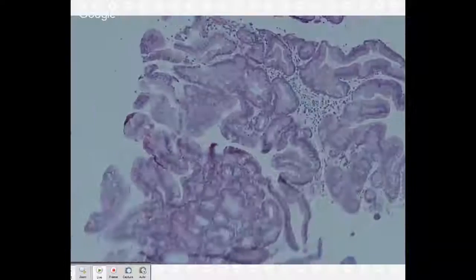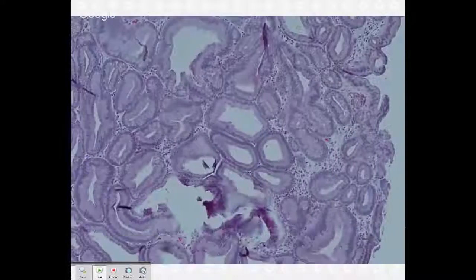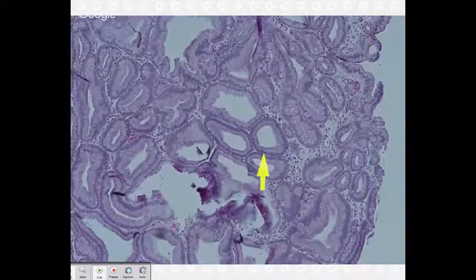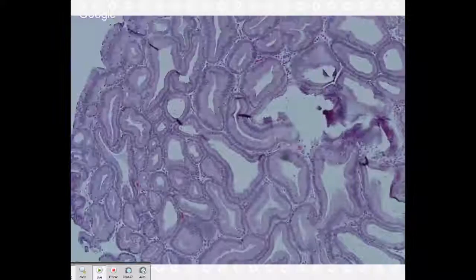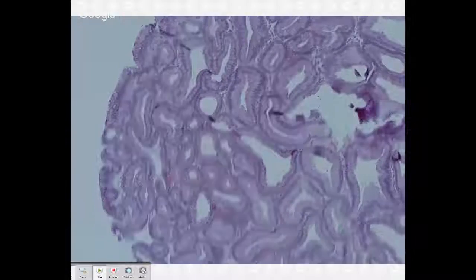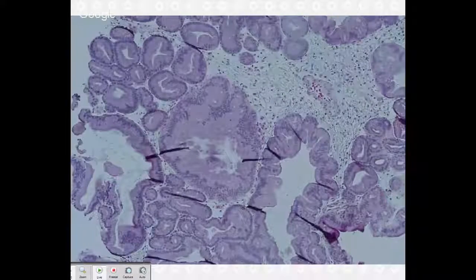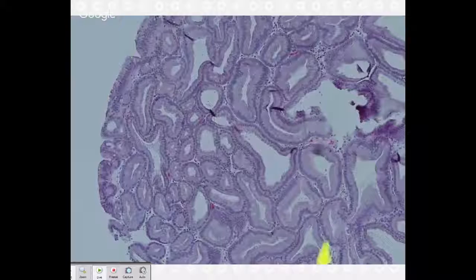How would you describe the cytoplasm? There's abundant cytoplasm. It has, I guess, apical vacuoles. Is it pink? Is it purple? Is it amphophilic? Don't know based on the color here. Yeah, okay, kind of fair. It is kind of amphophilic. That's true. The screenshot, unfortunately, is not exactly the way it looks under my microscope. True. And so you're right.